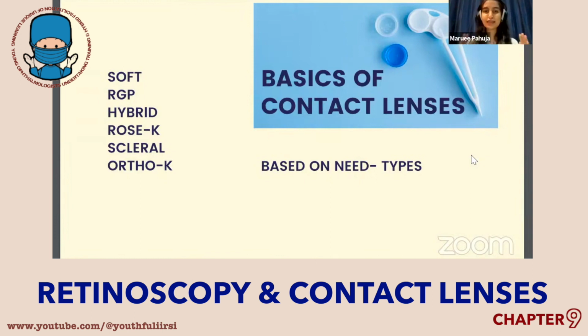Let's break it down a little bit and understand based on the need. There are different types of contact lenses, right? From soft contact lenses, which in itself has different modalities, based on the need and the purpose of the patient, we can give different types of contact lenses. We will be looking more into soft contact lenses in the coming slides.